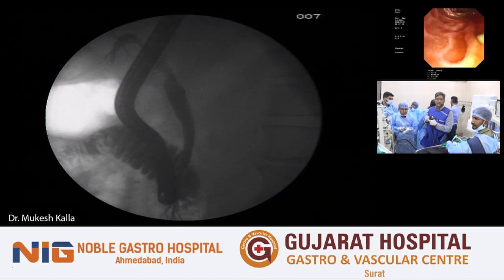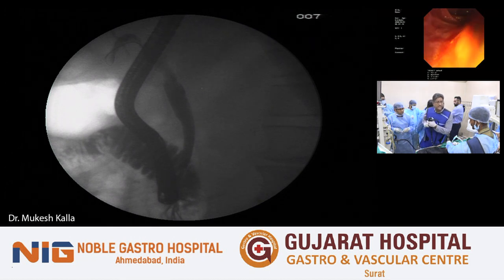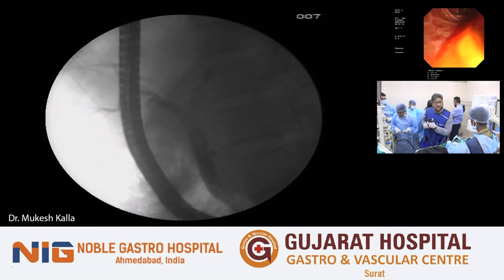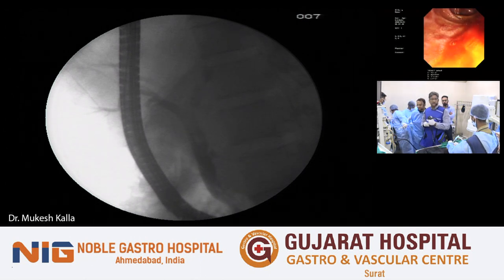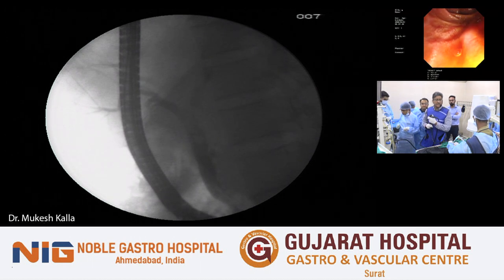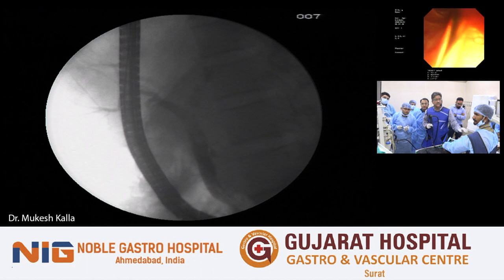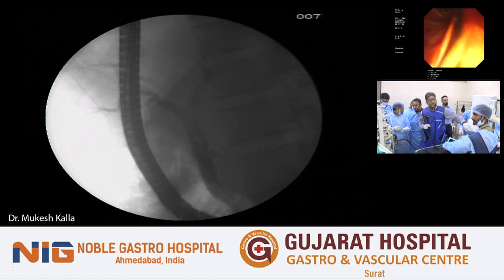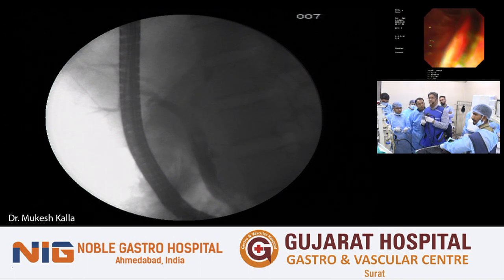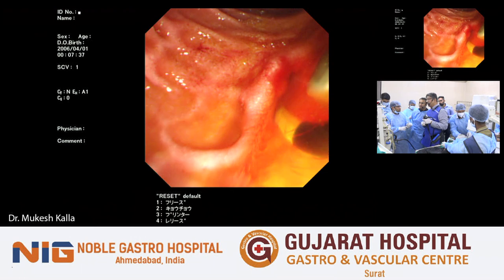Okay. So, Saurabh and Nilay, can you guide me on this? Can you see the cystic duct? Yeah, sir, I can see. It is posteriorly, and there is a small stump going towards the spine, and probably there is a stone stuck there. Yes. You want occlusion? Yes, now it is fine, let us put in the cholangioscope directly.